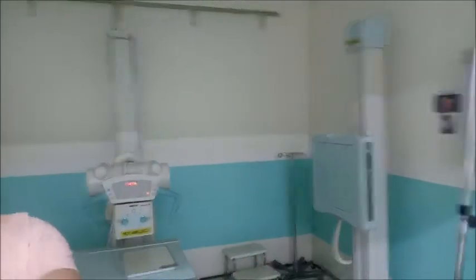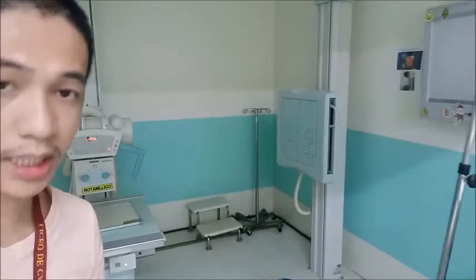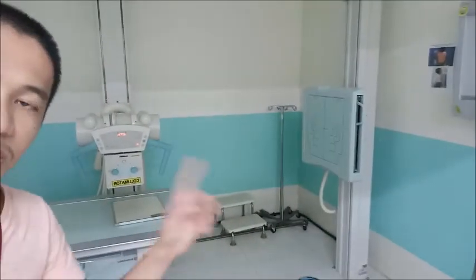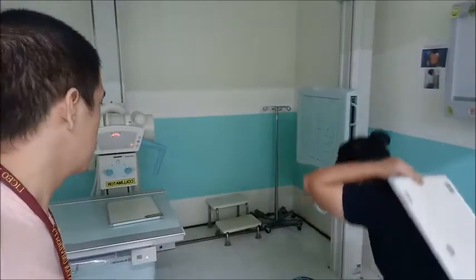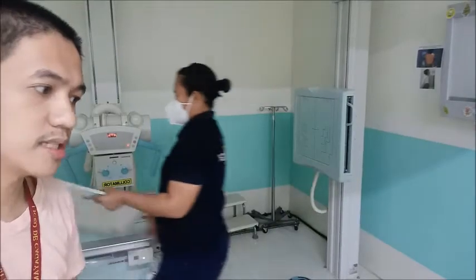Additional for the chest: the routine is chest PA. But if doctors request it, for patients with certain symptoms, they would require the lateral, but that is not the basic routine. For the lateral, compare with the chest PA general examination and chest lateral.